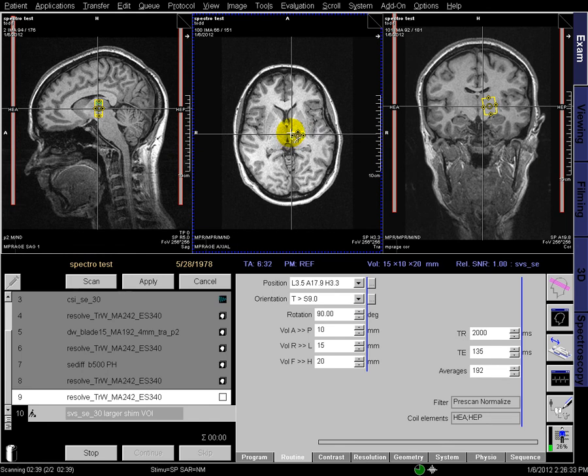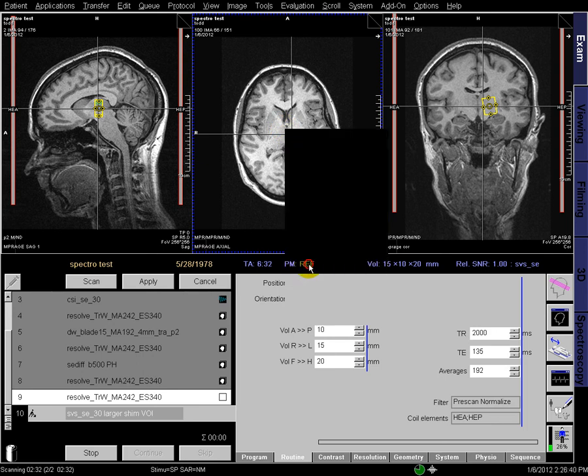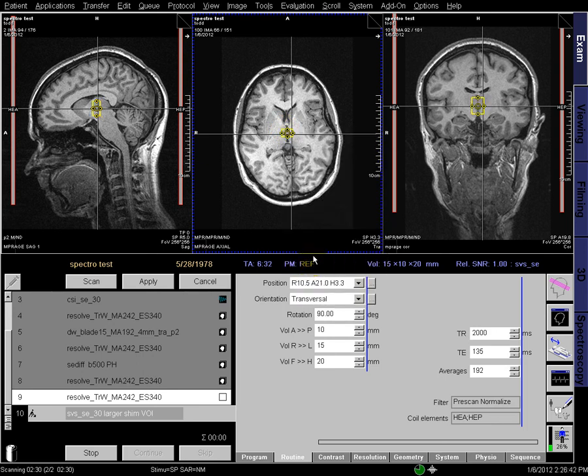Now we'll place that region of interest — the single voxel — in the thalamus where we're going to try to collect our spectra. The first thing we do is copy the image position. This takes all the underlying image information and applies it to the voxel so that we can do the overlays later.